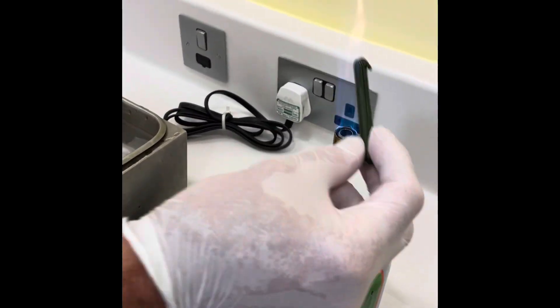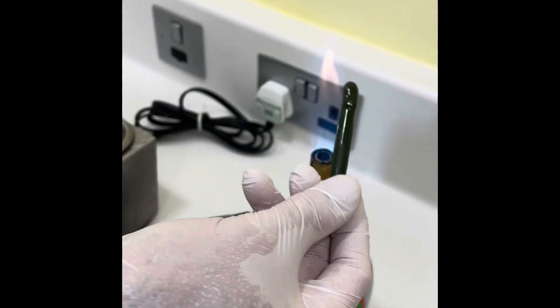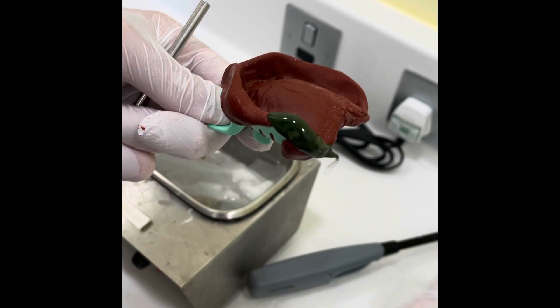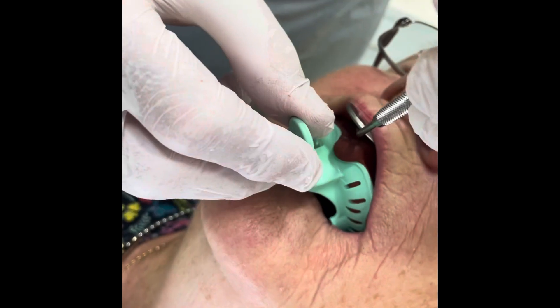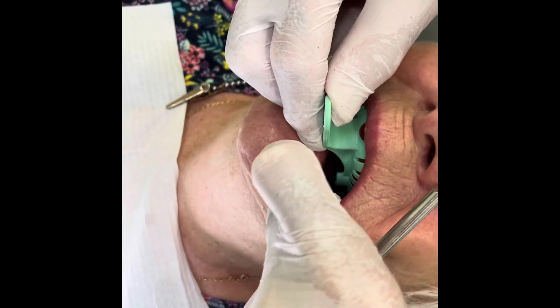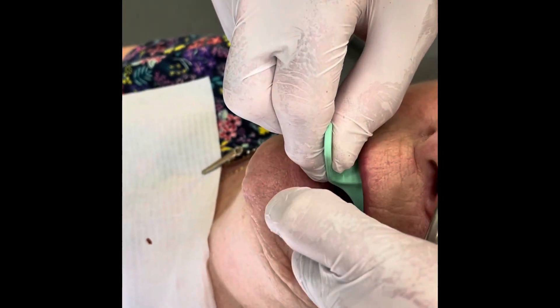So now go out and green stick one side at a time, small amounts — don't leave it in the flame. Just roll it across where you think you need the extension. Water bath. Insert a mirror, retract the tissues, close up slightly. Make sure it goes over the ridge into place. Now to make sure the green stick's got where you want, close your mouth slightly — you just push from the outside and the green stick gets pushed into the sulcus. Then ask the patient to move their chin left or right. Open up, take that out.